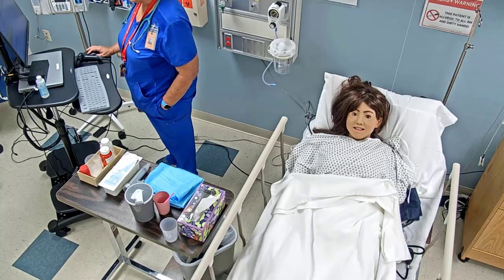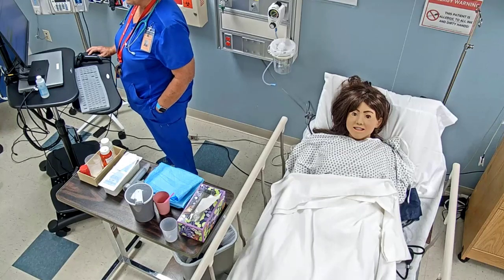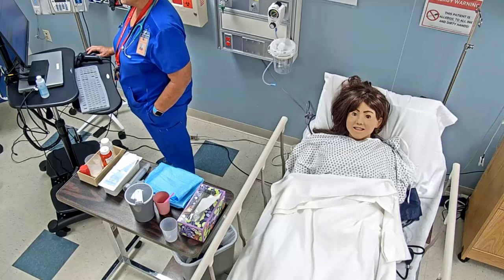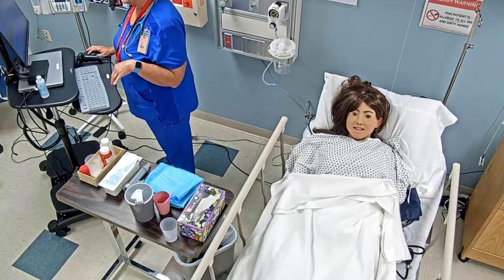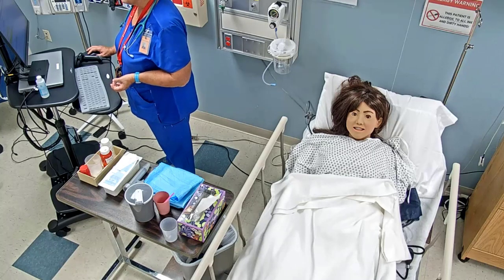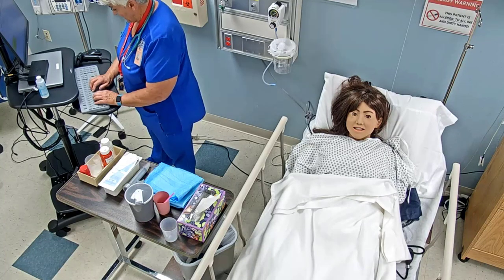That's the last medication that I'm going to be giving per peg, but I just want to read it again. Flush peg tube with 15 mils of water before and after each medication. Like I said, the policy says 30 mils to irrigate with, and then 15 at the end and 15 between meds. But the doctor specifically says 15 before and after.